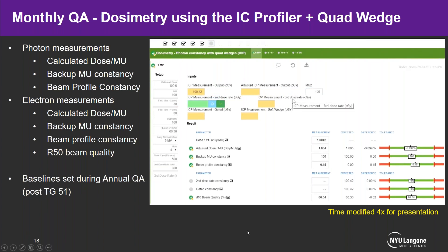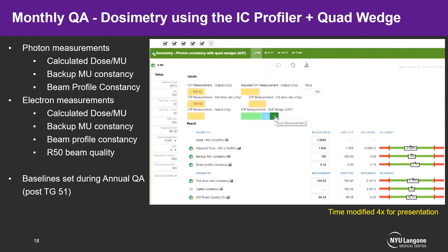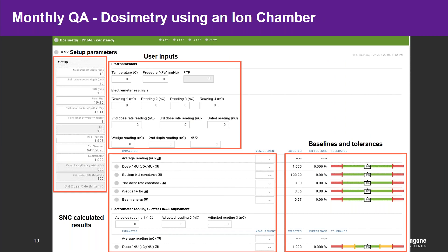For electrons it's even simpler — in that first measurement you're doing your output, beam profile constancy, and R50 beam quality all at once. The baselines can easily be set during your annual QA after TG-51 or after machine service when resetting is warranted. For a monthly QA you can also do it traditionally using an ion chamber in water or solid water. The execution screen shows your measurement depths, SSD, field size, chamber calibration factor, TG-51 factors including P-pol, P-ion, and KQ, as well as an electrometer factor and temperature-pressure corrections.